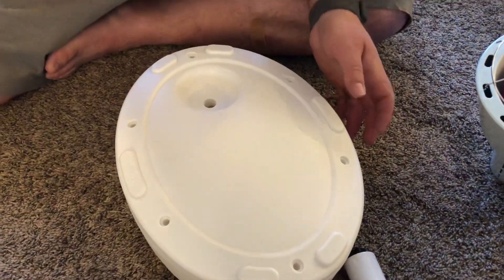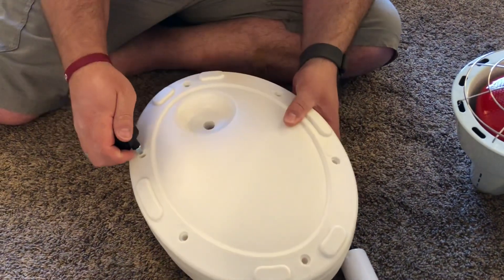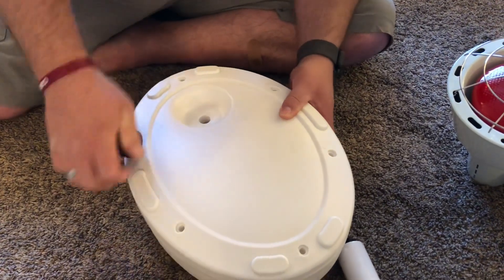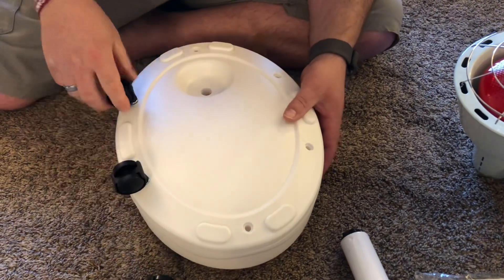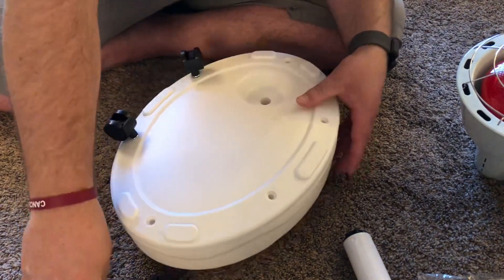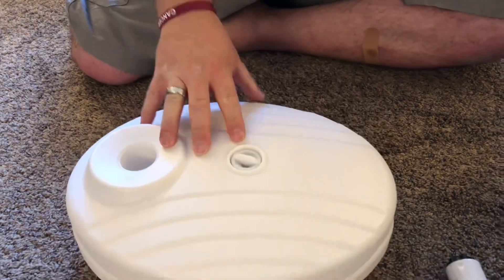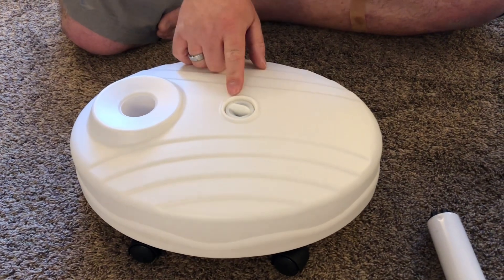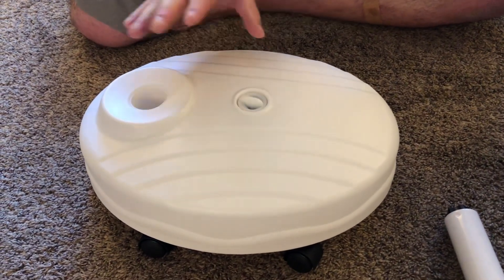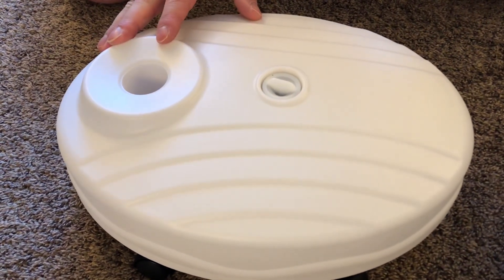It comes with some casters and you're just going to flip the base over and push in all of these casters. They're just simple pressure fit all the way around. This base does need to be filled up with either water or sand to make sure it's got enough weight to be stable enough to hold the lamp up.